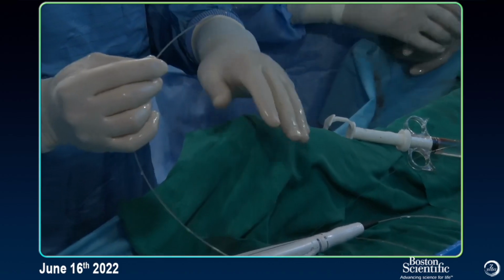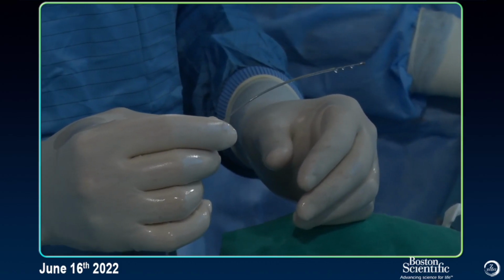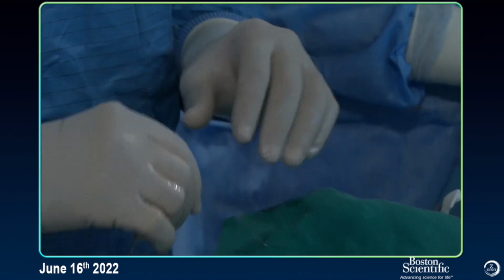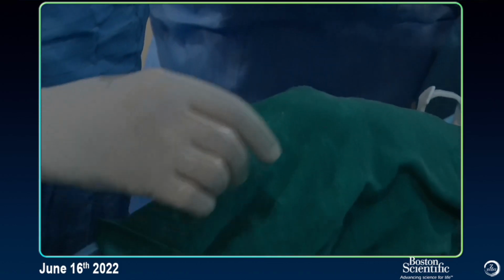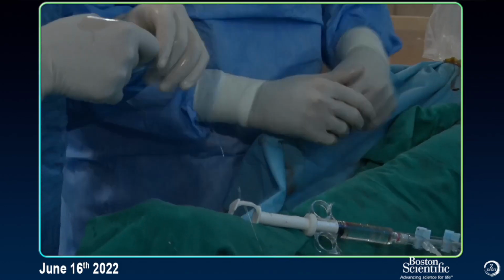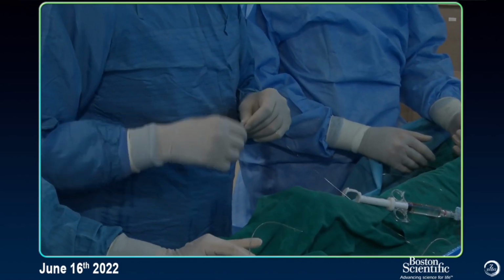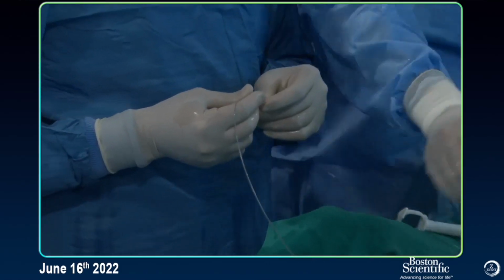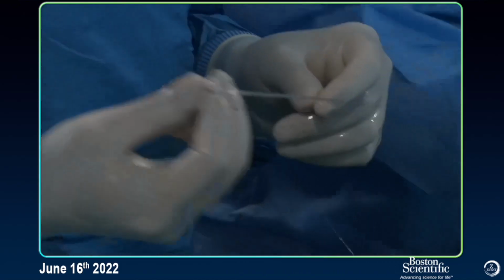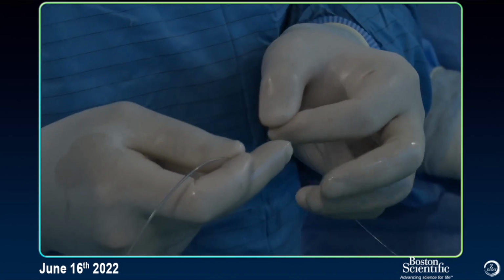Professor Ömer, before you move on, just quickly, Dr. Assad mentioned the good thing that we usually use the Rotaglide. It's already a ready-made solution for you in the US, but in the Middle East, you do your own. Do you do your own solution? No, we don't use a specific fluid for that. No. But since I have heard it from Esad, I am doing it now in all my procedures.